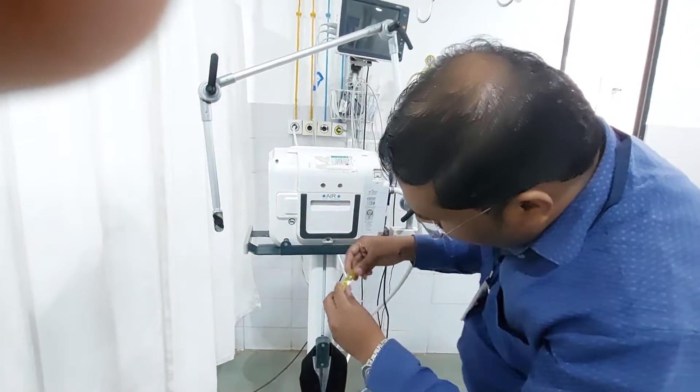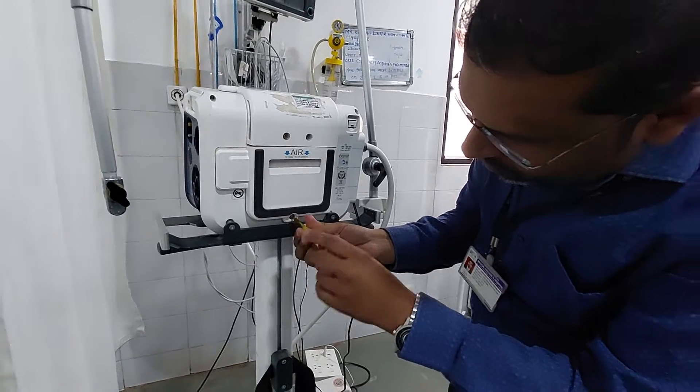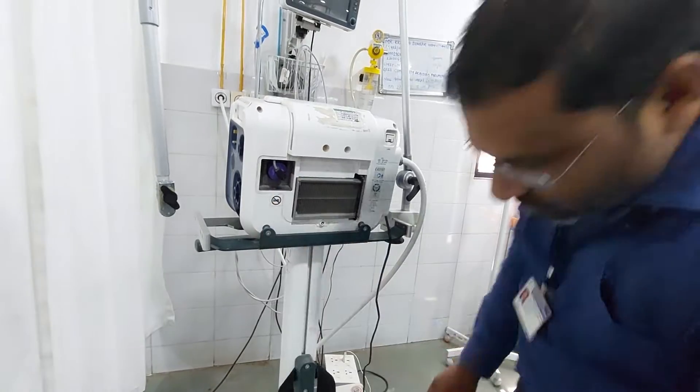...at the bottom there is a small screw. Just remove the screw. This cover will come downward — remove the cover. You can observe, this is nothing but the O2 cell.